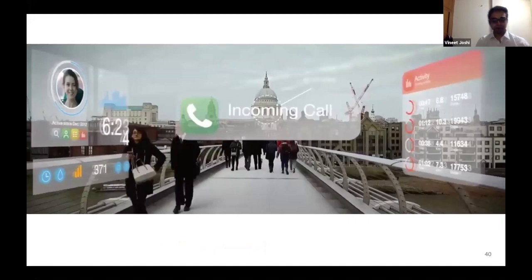An interesting innovation by a group called eMacula, where they filed a patent for a dual system of contact lens and glasses, where the glasses were able to perform a digital overlay over the contact lens. And imagine you would see a view like this. This is something definitely out of a sci-fi movie. And these technologies are now on the brink, and it will happen soon that such paired devices will come into the picture.